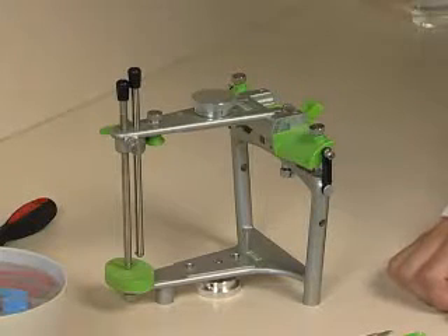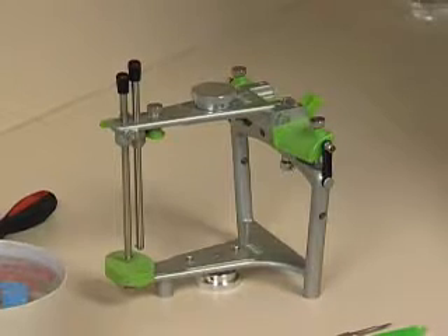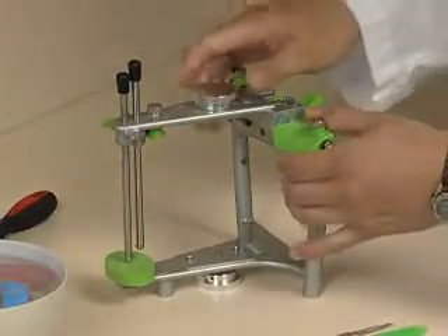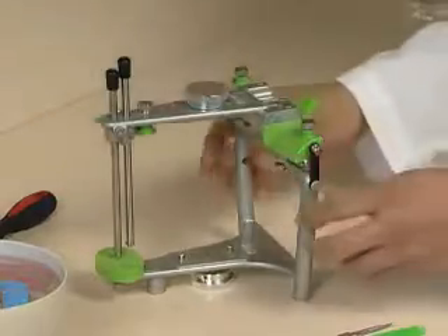I'm going to mount the upper model now, and I've recruited Dr. Jorge to help me with this. He's going to set up the articulator first to prepare to mount the upper model. The first thing he's going to do is set the analogs at 45 degrees on both sides.